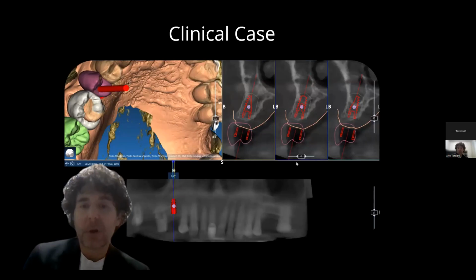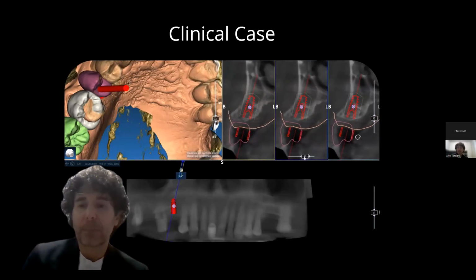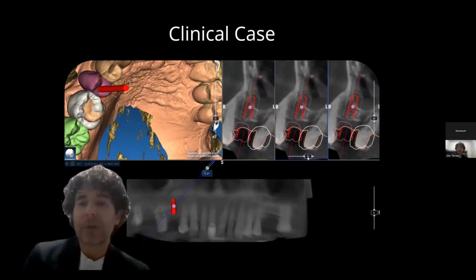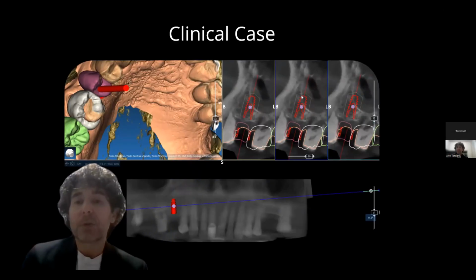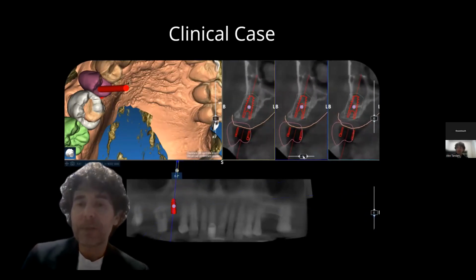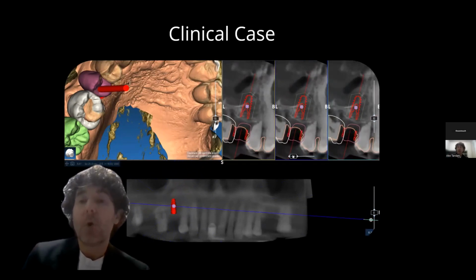But the moment we perform this simple movement, we see that we are at the point where the maxillary sinus is in its most mesial part. So we are faced with an area that is not flat, but quite the contrary, with varying heights. So it must be approached a bit more carefully to ensure a sinus lift that is straightforward but risk-free. So it's not a case to start with, not a case for a beginner of this.